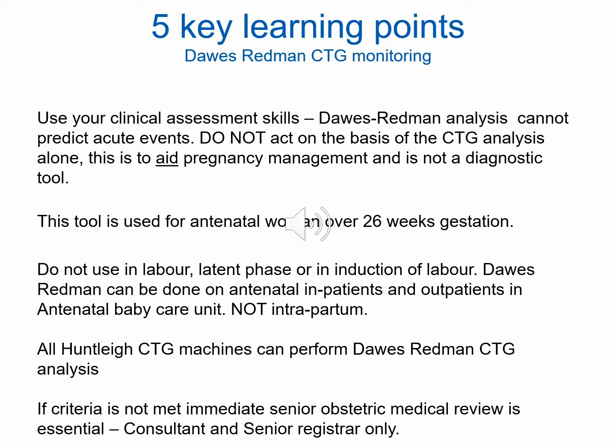Do not use in labor, latent phase, or during the process of induction of labor. It can be done on antenatal inpatients or outpatients, but not intrapartum. All Huntleigh CTG machines can perform Redman CTG analysis. If criteria are not met or the CTG looks abnormal, immediate senior obstetric medical review and an SBAR analysis is essential, and this should be with a consultant or a senior registrar.